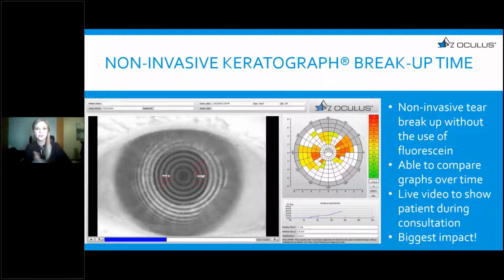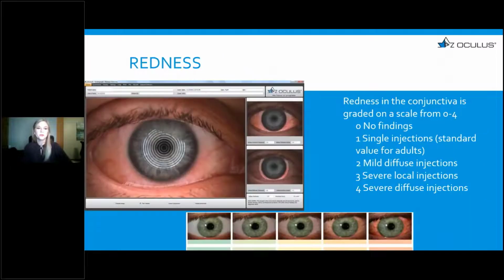And for a patient like this, I would say after about 5 seconds, the tears started evaporating from your eyes. And after about 10, most of them were gone. So the number I like to see is maybe 15 to 20 seconds. And when I put it into that perspective, they say, wow, my tears are really staying on about 1/3 of what someone should. So that really gets down to the root of the problem and shows them there is something going on, okay?